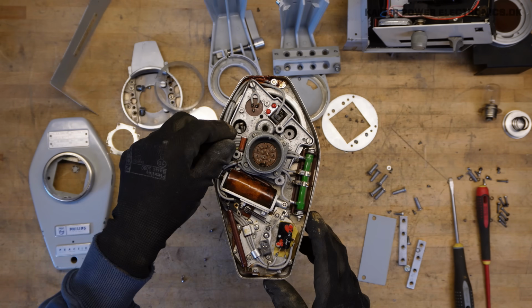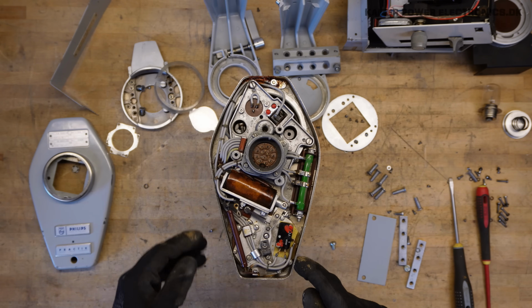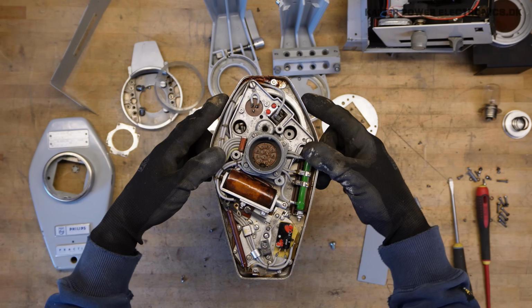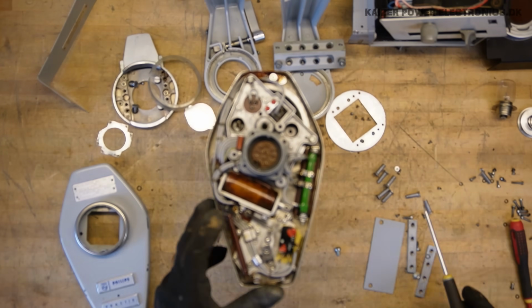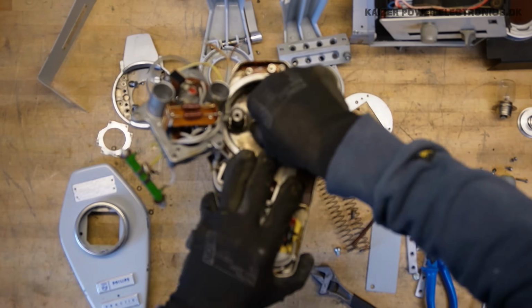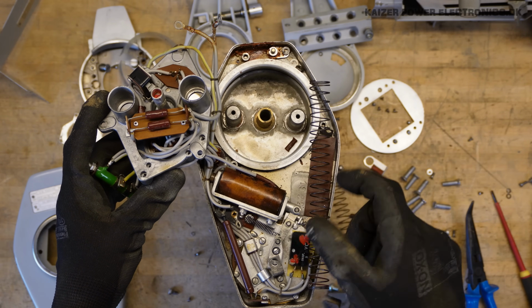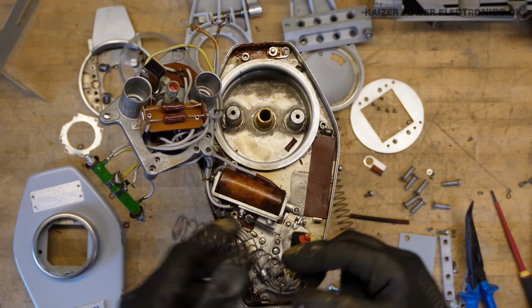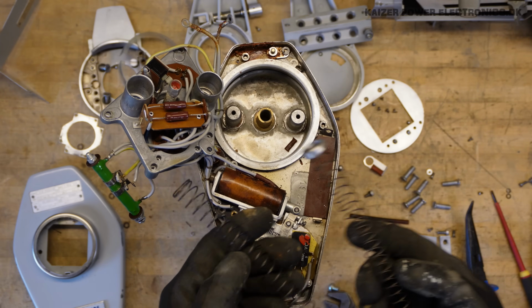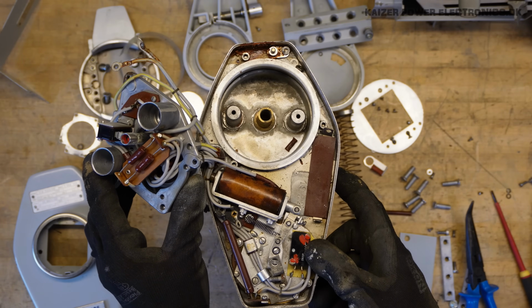But again, there's some more stuff to take apart here. Clearly we have the tube sitting down here, because we have the window here. Up here we will have the transformer itself. This is quite weird. I'm pretty sure this is the high voltage transformer, and it had these two springs going down over this. This appears to be all metal, so it's not like it's some kind of electrical connection.